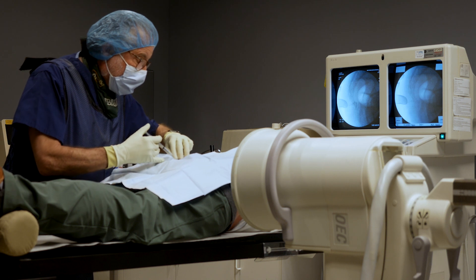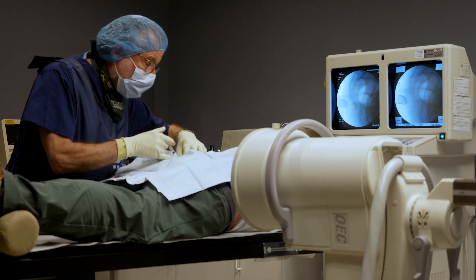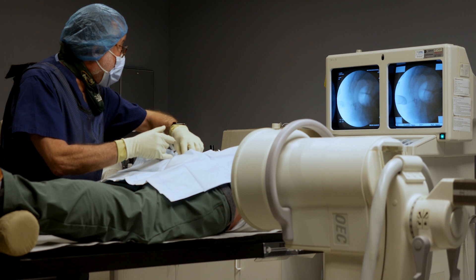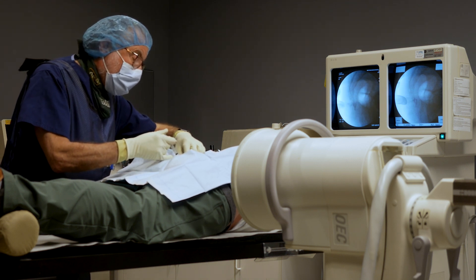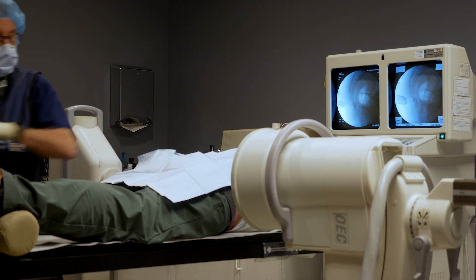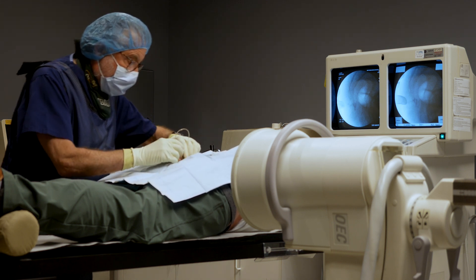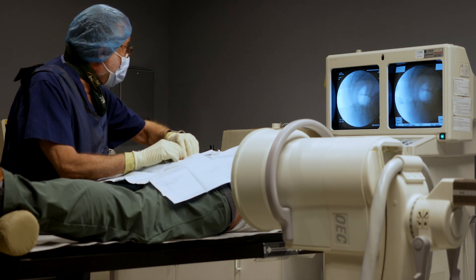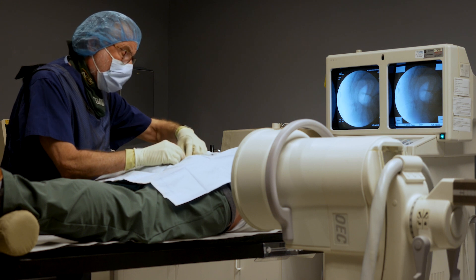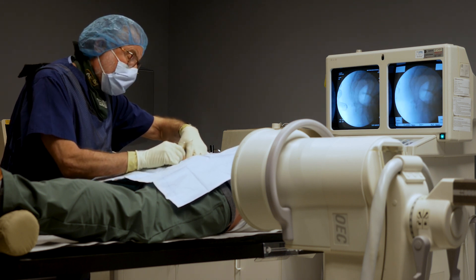Here comes a little poke on the left side. A bit more sensitive on the left side. The other side here is on the screen. The right side is the center, the left side is here — one is on top.